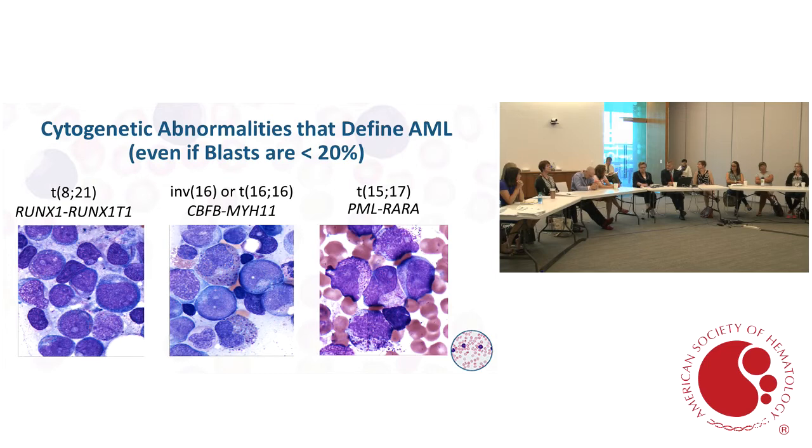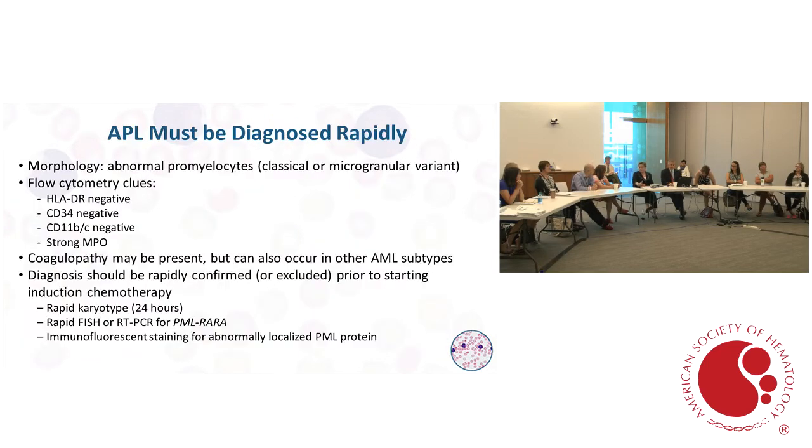And I have to say, we have automated karyotyping systems now that allow us to do the imaging much faster. It's no longer photography and cutting chromosomes out. So the record keeping on that is a lot easier as well.